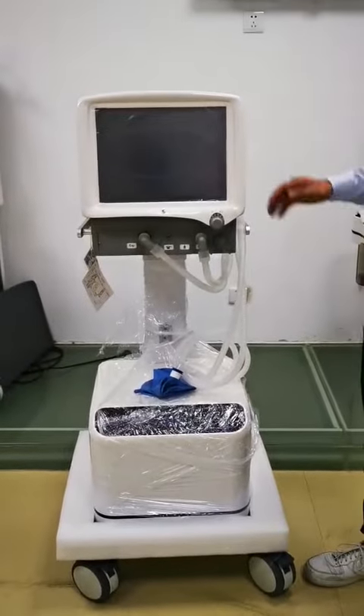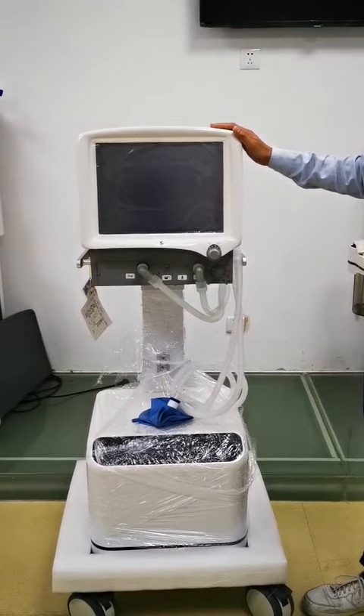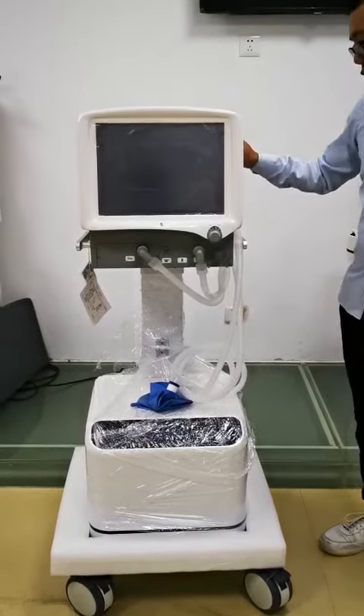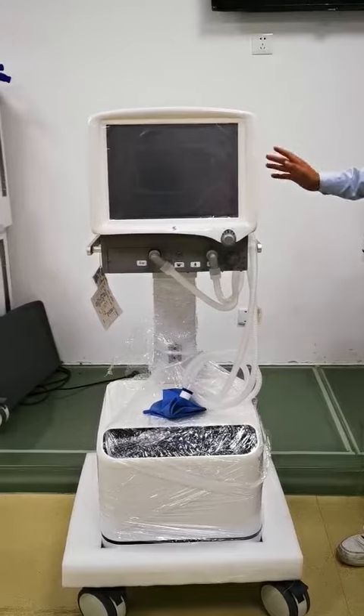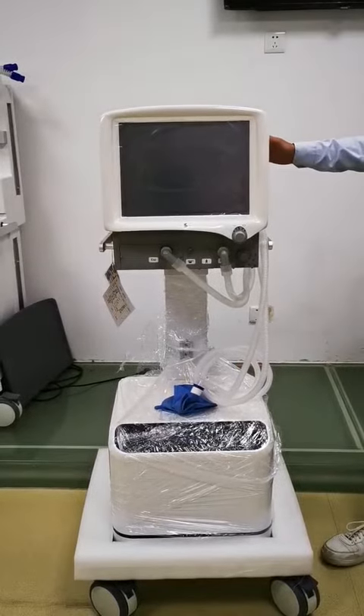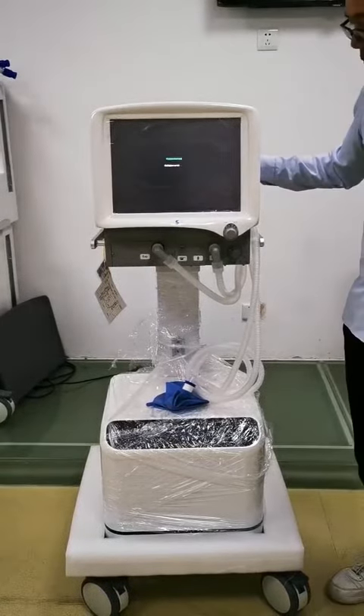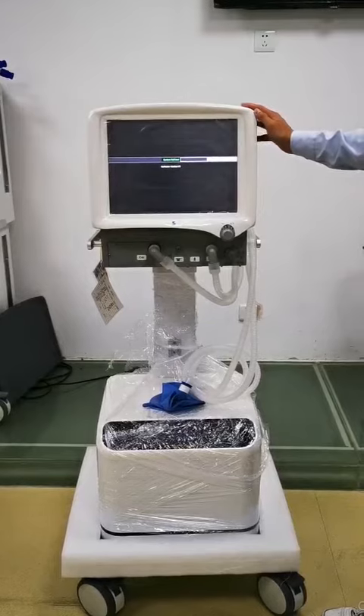Now we will do the 100% oxygen concentration calibration. The same steps apply — we need to turn off the air compressor and only supply the oxygen. Then we switch on the machine.